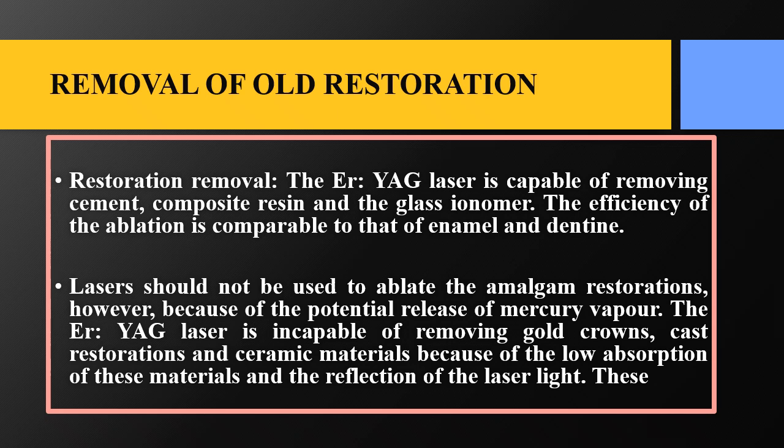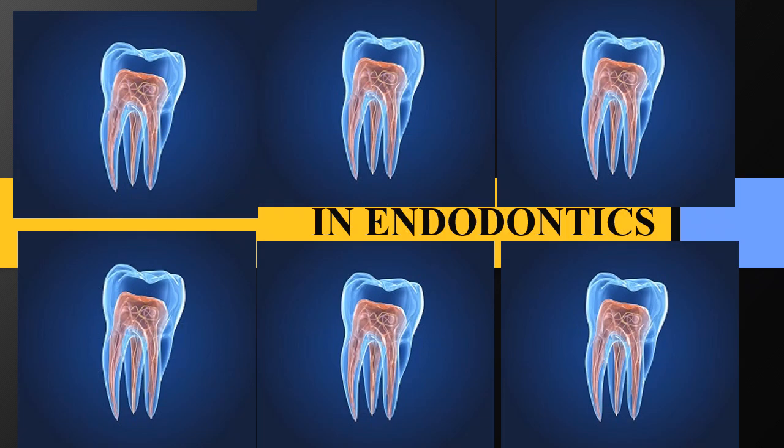Lasers are also used for removal of old restorative materials. Erbium lasers, which are hard tissue lasers, are used for cavity preparation and for cavity etching. The same laser is used for removal of older restorations too.